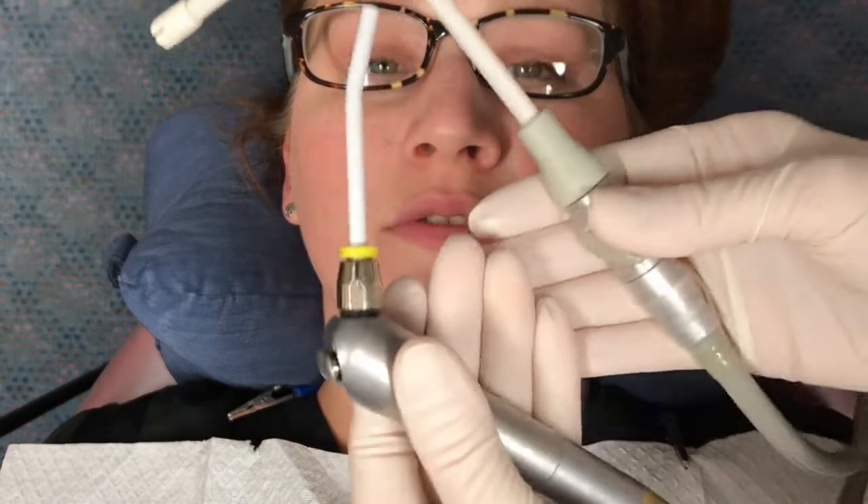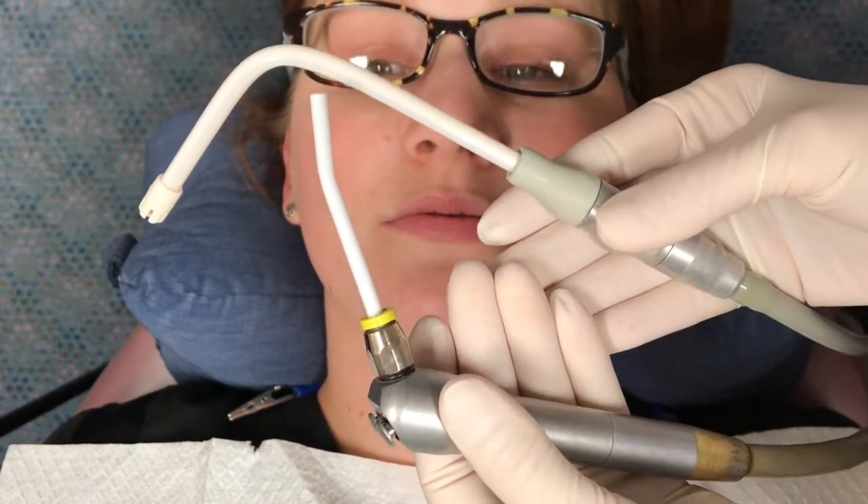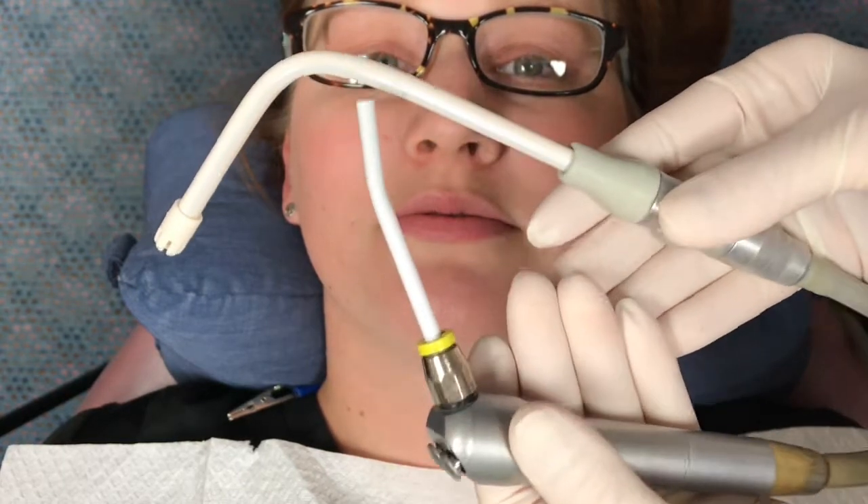Grasp the air water syringe in your left hand and the HVE or saliva ejector in your right hand. Turn on the suction.